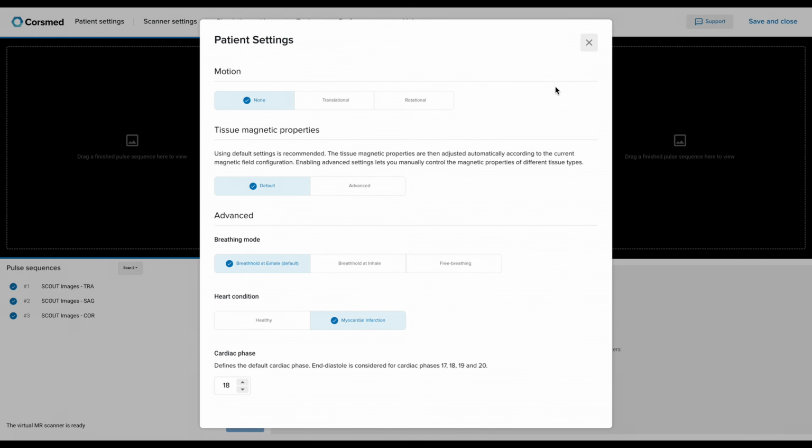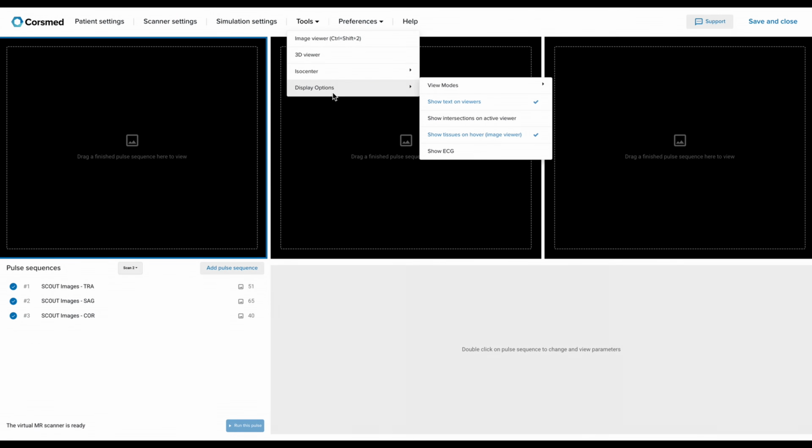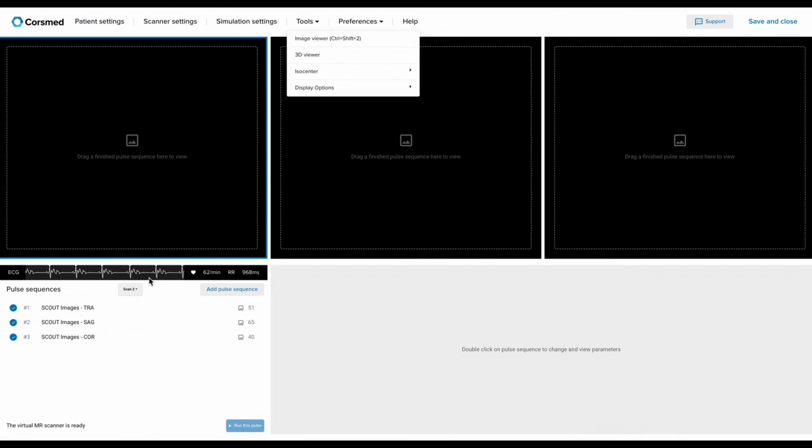Before placing the patient in the scanner, we should also make sure to ECG-gate the study. ECG gating means we use the patient's electrocardiogram to make sure we capture images at exactly the same time point in each heartbeat. If we capture images at different phases of the cardiac cycle, we would risk getting motion artifacts caused by the heart beating.